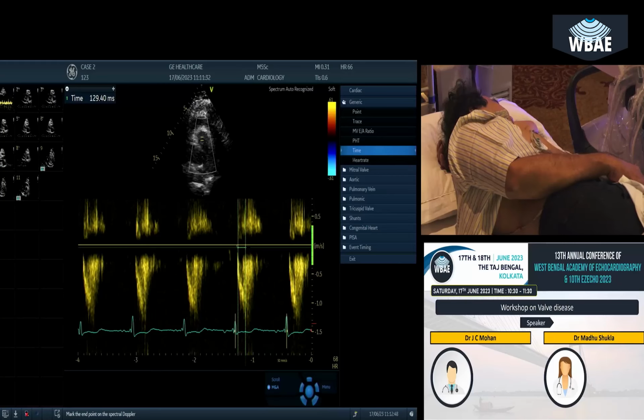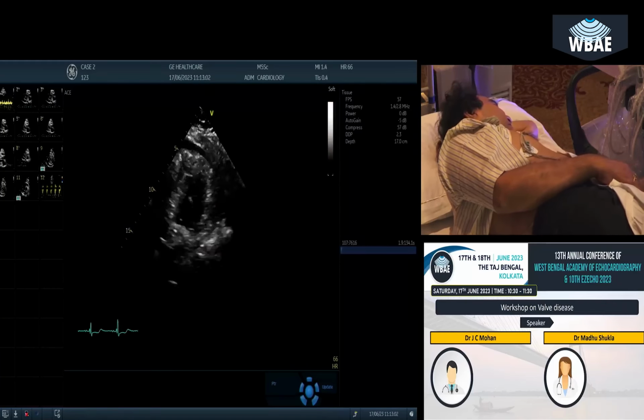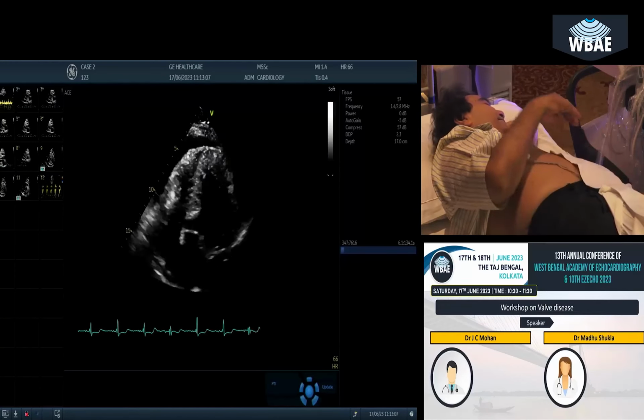I disagree on that, but this does not mean that the patient doesn't have pulmonary hypertension. It only means we have issues with regard to measurement. Forget about it. Let us actually now go to apical views. Okay. Yeah, absolutely. We should look for RVOT gradient.